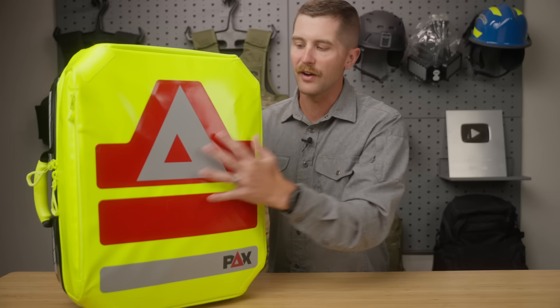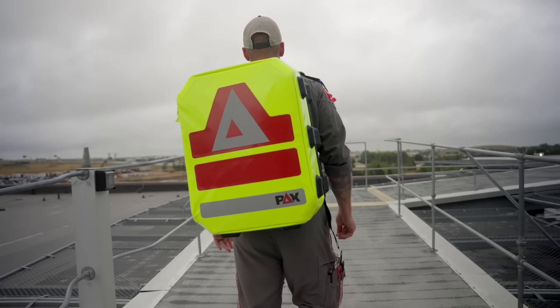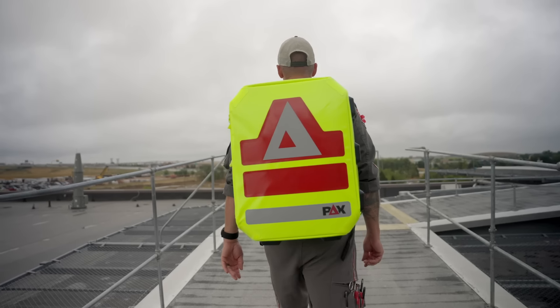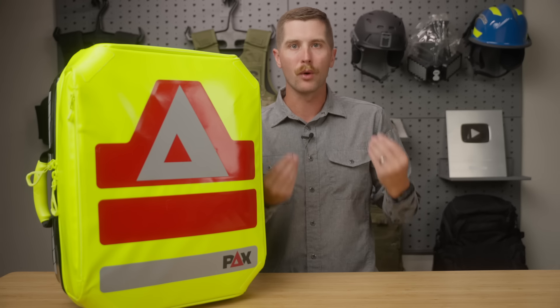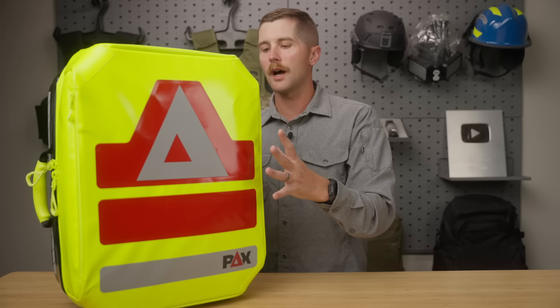The outside is a very sturdy fabric that is completely deconable. They weld this very, very well. So if you've got bodily juices or what have you, you can wipe it off and it's not going to be an issue. We see that a lot in some of the USA packs where they are a porous fabric and you get blood on them — it's very, very hard to get that out. So very deconable on the outside.